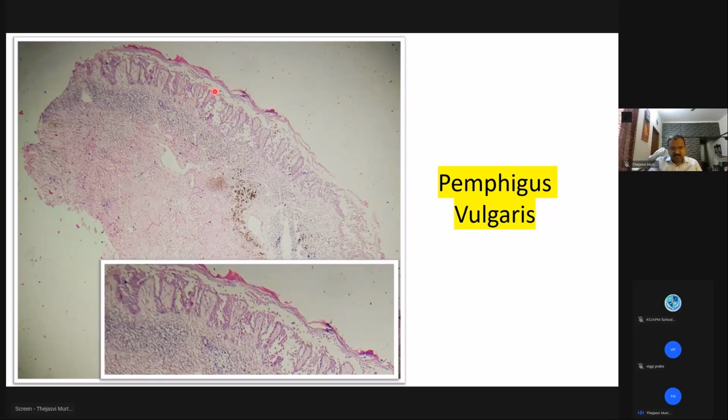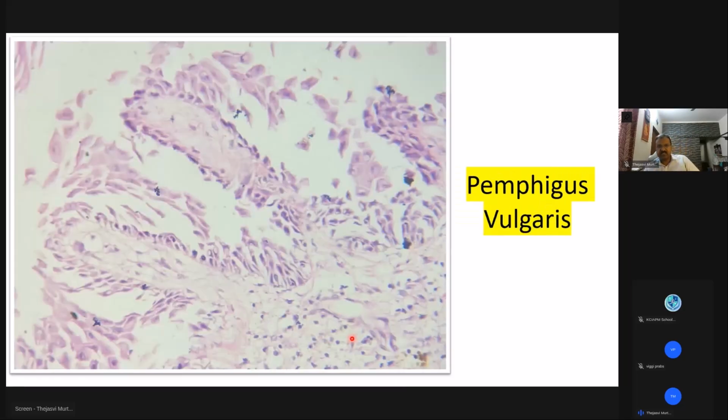Okay, there is what has been highlighted in the inset. There is a basal layer that is preserved along. So it is called the preserved tombstones whenever it is dislodged. There's some amount of acantholysis as well here. So it is pemphigus vulgaris. See, you can see acantholysis, these are acantholytic cells. These are the remaining basal cells over here. And this is a case of pemphigus vulgaris.